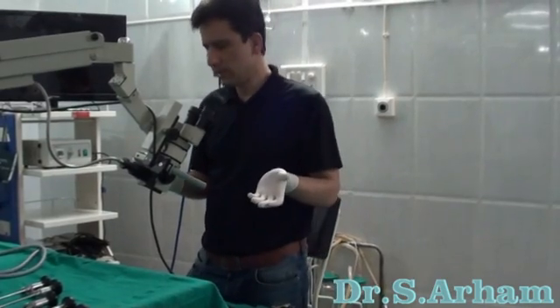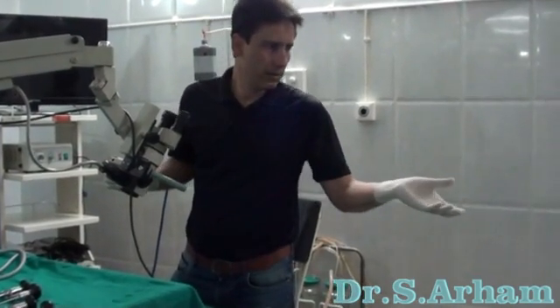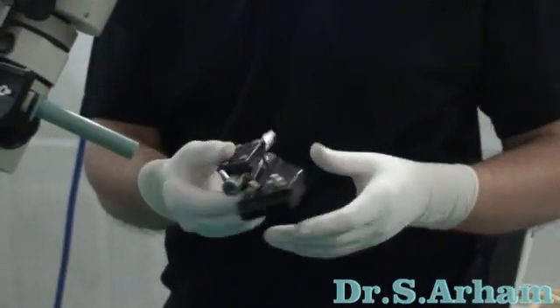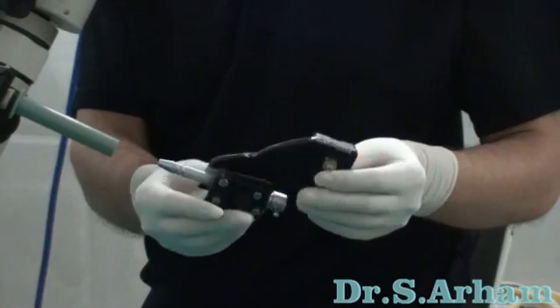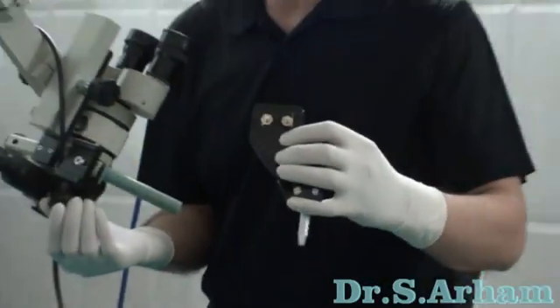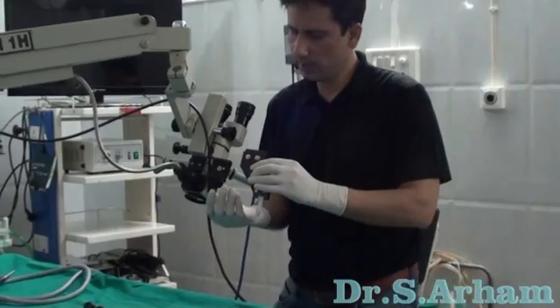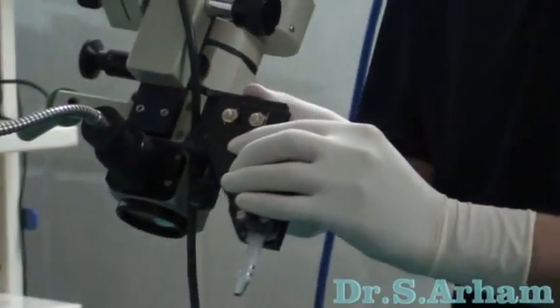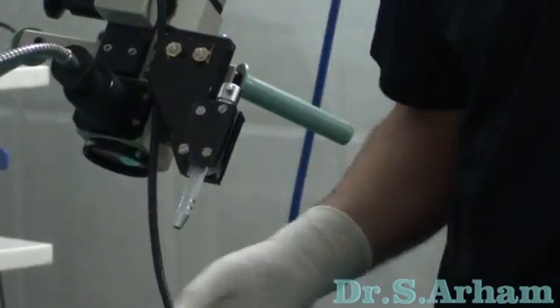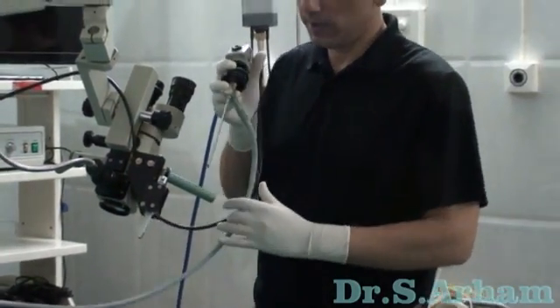The designs which I have prepared — you can watch this second design. This is a small assembly for my endoscope. I can fix this assembly directly to my microscope in less than 20 seconds. And I am able to use this endoscope along with this microscope.